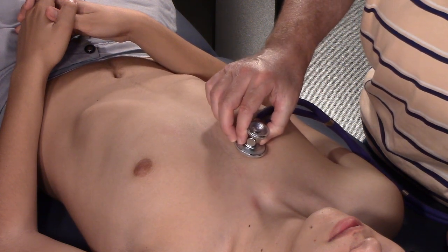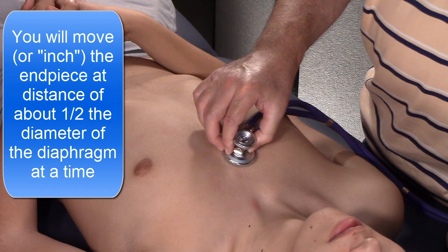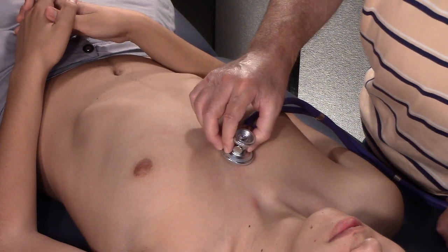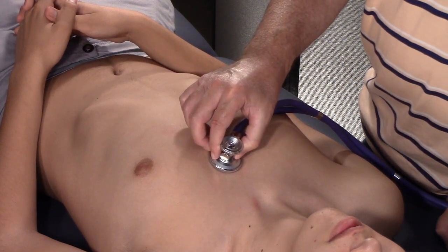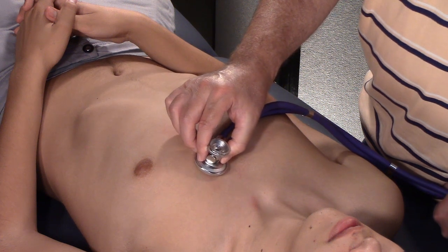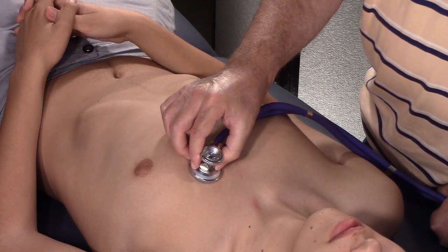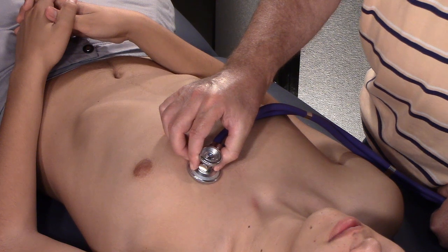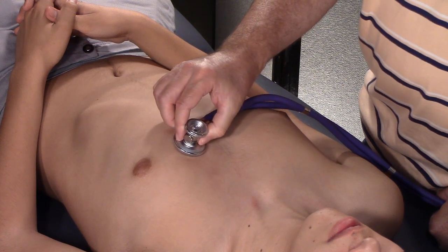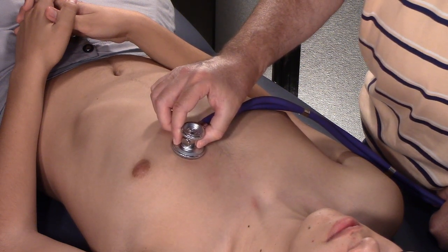Move about half a diaphragm width at a time — lift it up a little and move. We're working our way over to the pulmonic cardiac region, where we hear the pulmonic valve. That's the top of the Z. Now we inch our way down — you can almost feel the ribs with your stethoscope. There's the third intercostal space: Erb's point.